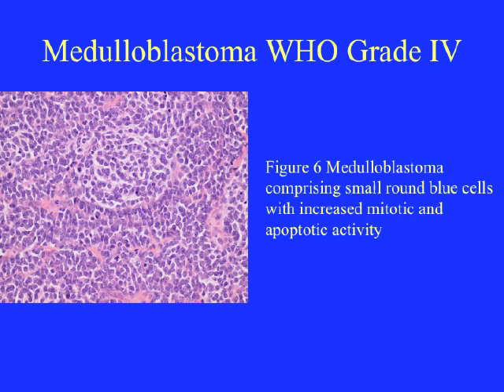This is a medulloblastoma WHO grade 4, typically seen in the posterior fossa of children. It is characterised by sheets of small round blue cells with increased mitotic and apoptotic activity. This tumour is positive for neuronal markers such as synaptophysin and NeuN, as well as glial markers such as GFAP. There are various subtypes of medulloblastoma, some of which have a better and some a worse prognosis.